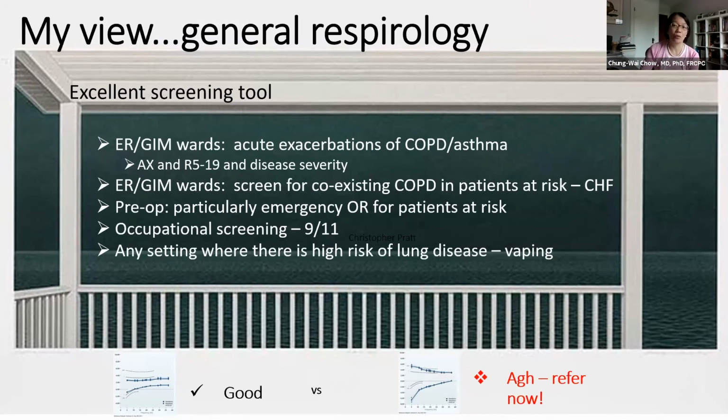And it likely has a role, in fact, I know that it has a role from speaking with colleagues, in the management and follow-up of patients with asthma and COPD. The take-home message for today is that oscillometry tells you that there's graft injury. And we don't always get that information. In fact, we usually don't get that information from spirometry until it's a bit too late.